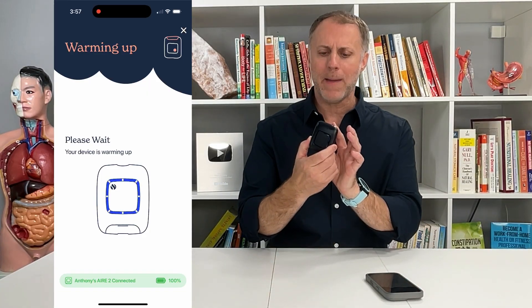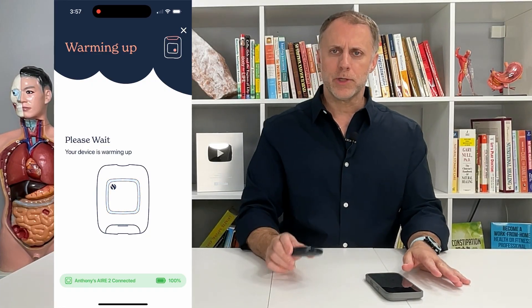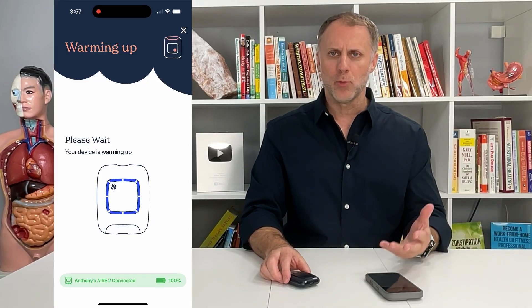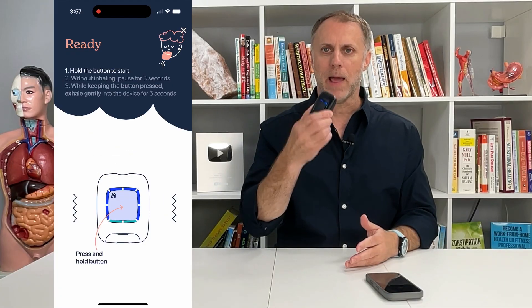When it's ready, you're going to blow into this mouthpiece. The way that you do it is you're going to try to breathe normal. You don't want to take a big inhale and take a lot of breath in, because then you're just testing that breath.